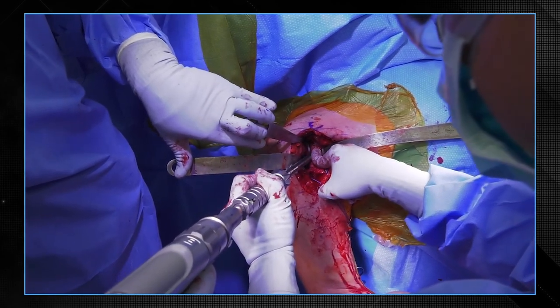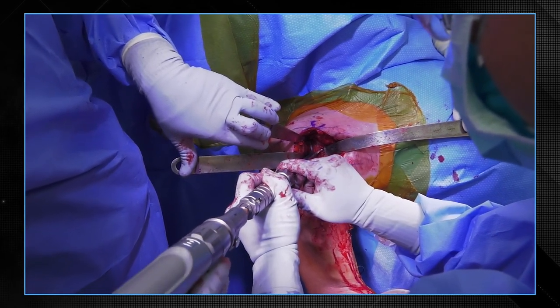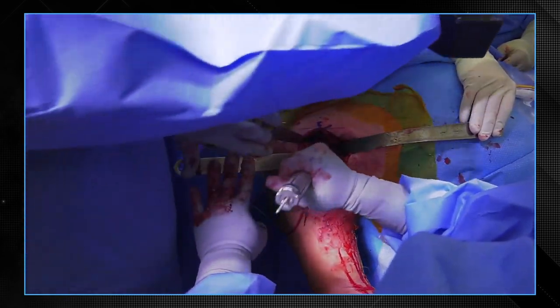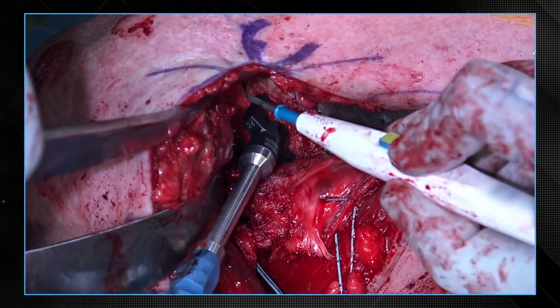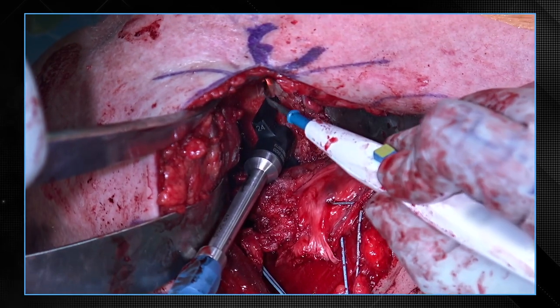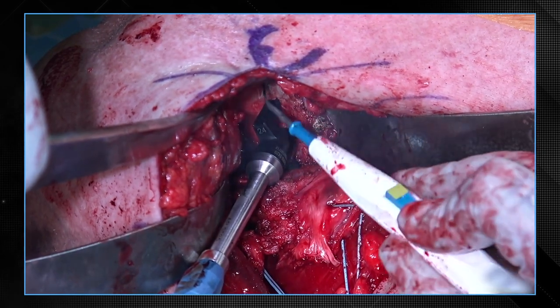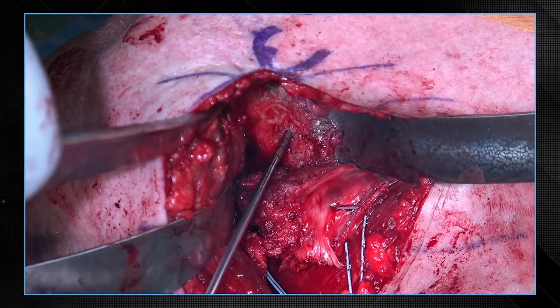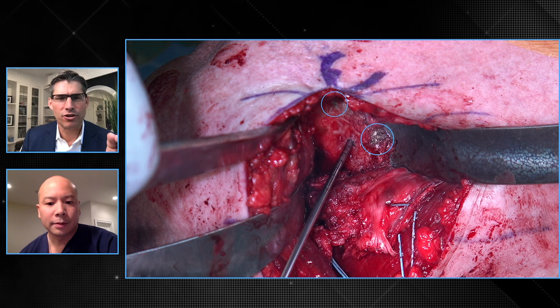When it's on, it's extremely solid — exactly where you put the VIP plan. We set this with a flexible guide pin, which allows ease of putting instruments in and out. Here we're using a guide to look at the maximal offset, and this for me is to double-check my VIP plan. We basically mark with the Bovie where we want to position our reamer. If you don't have a guide, or there's an osteophyte that was removed and the guide doesn't fit as well as you anticipated, you can still use this to determine where the maximal offset is to put the wedge — a backup to make sure your deformity is what you thought it was and where you're going to ream is exactly in the right clock-face orientation.